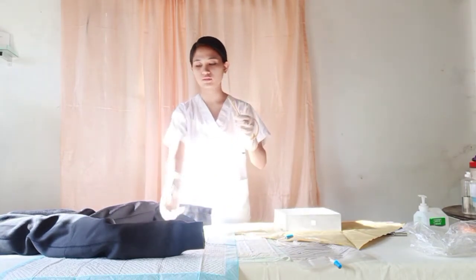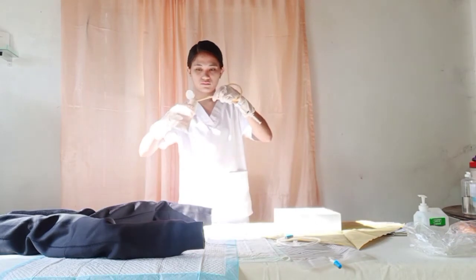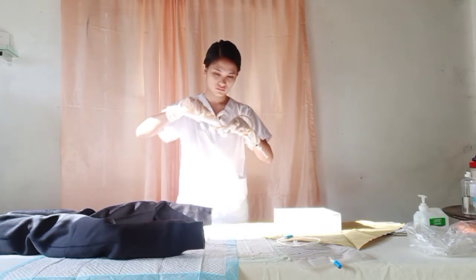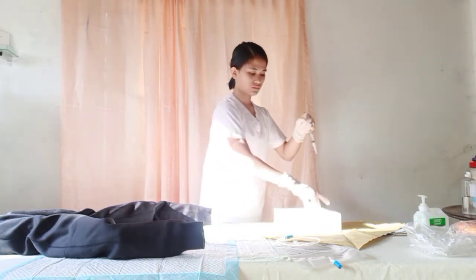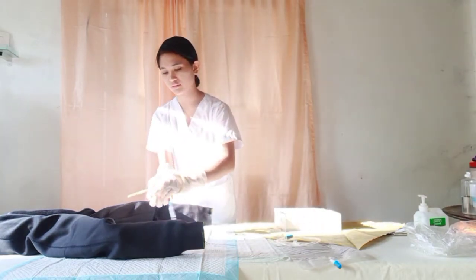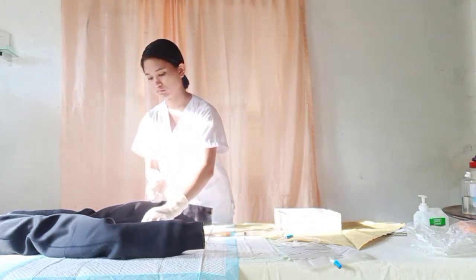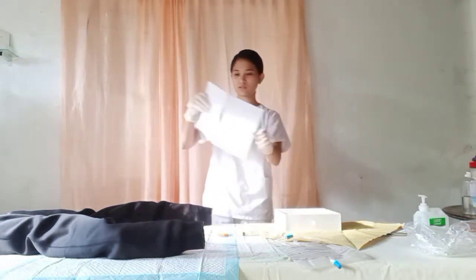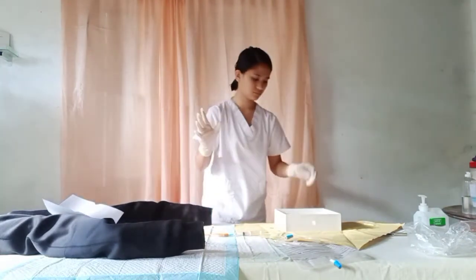Now ready to lubricate the catheter. And then place the end of the tubing on the tray. Place the sheet on the meatus and then prepare to clean the meatus.